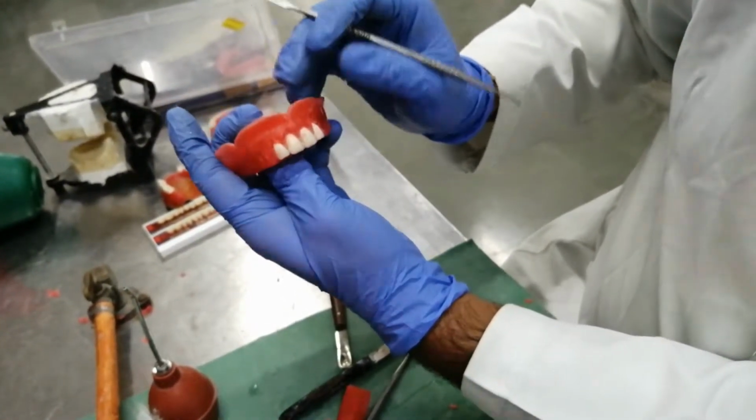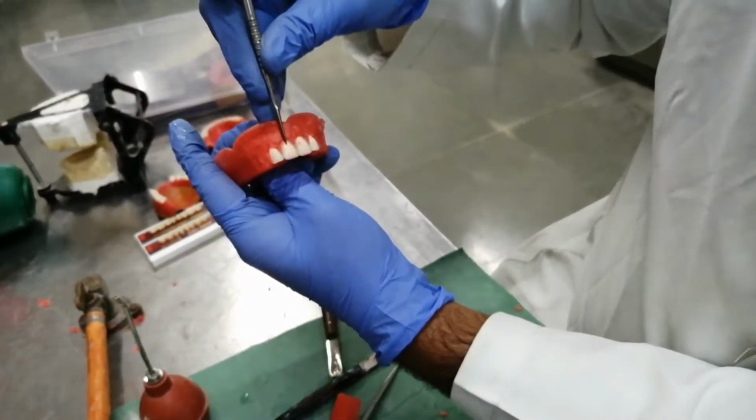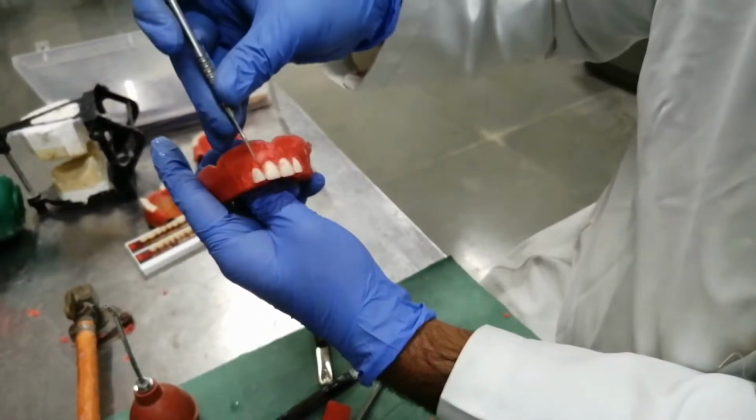Now we will check the inclinations. The midline, long axis slope towards the mesial, neck depressed.